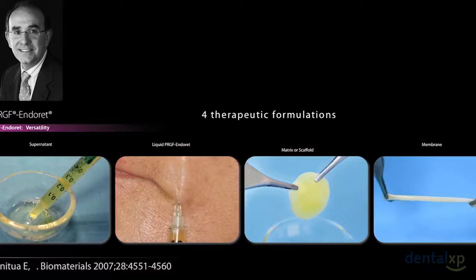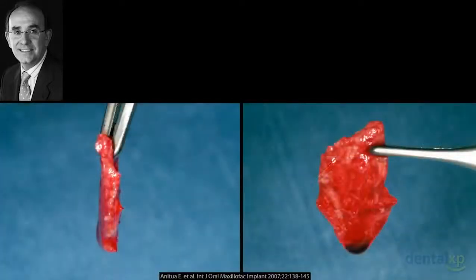This is our approach for tissue engineering, and all my grafts are always sticky, in a clot of the PRGF. I increase the volume of my graft, and at the same time, I obtain a graft that is sticky, and I can place it exactly in the position.